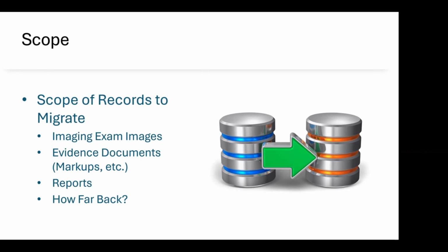For example, you have to make decisions like, when you do these routine modality calibration images like CTs, where you're using phantoms and stuff, those are required to be kept for a period of time that clinical engineering has to keep as evidence they've been doing it, but they may not need 10-year-old ones or 5-year-old ones. And depending on how disciplined you were in acquiring those and consistent you were in terms of the artificial patient you were using, if they've been randomly typing stuff in, they may be harder to detect just by looking at the data go by. So you have to be prepared to have a decision on those.